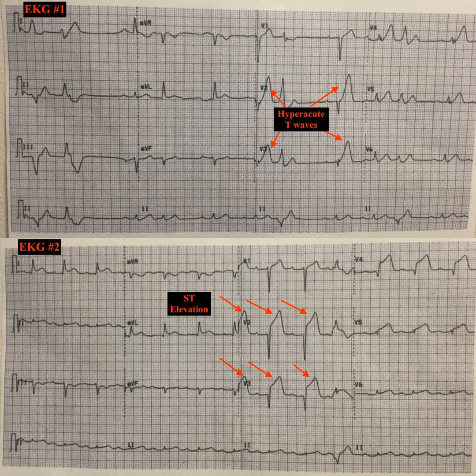Okay. So this illustrates these hyperacute T waves in the precordial leads, and this is the subsequent EKG, which was 30 minutes later. So you can see that is a much more characteristic finding, less likely to be missed as a STEMI than this.